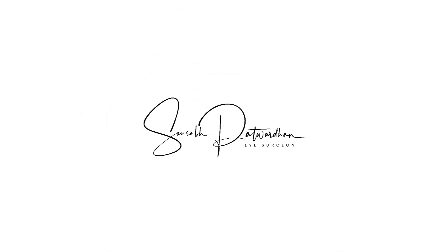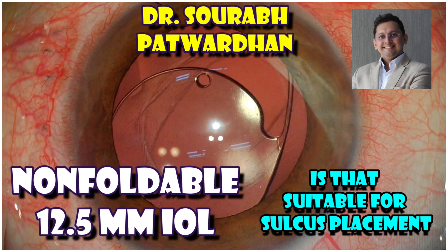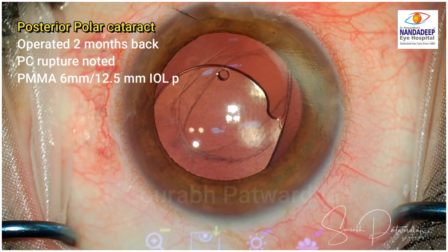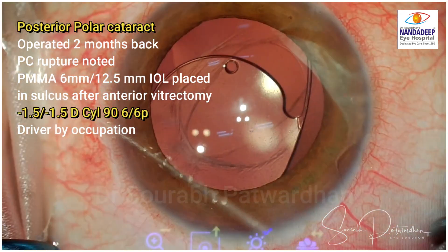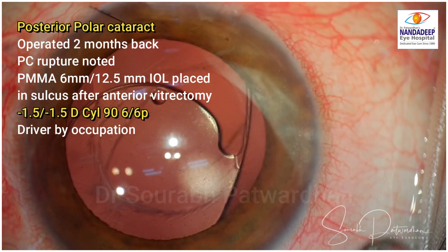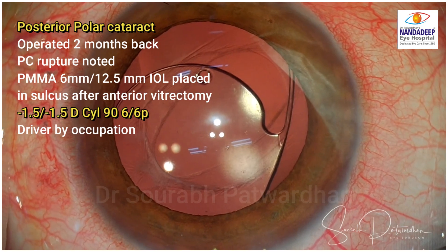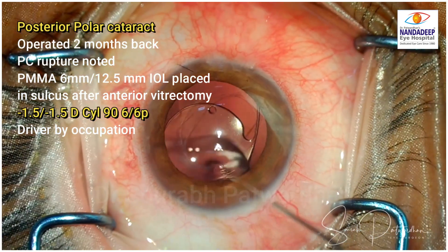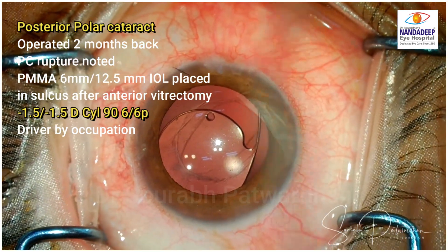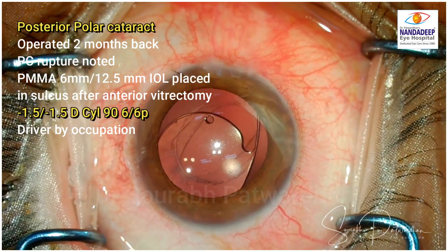When there is a PC defect and we have to place the IOL in the sulcus, most commonly we use a non-foldable larger optic IOL which is the least expensive option. This is a case where the patient had posteropolar cataract. The other eye was operated elsewhere and the surgeon noted PC rupture. After anterior vitrectomy, a PMMA IOL of 6mm optic and 12.5mm overall diameter was placed in the sulcus. This patient was suffering from some refractive error — there is cylinder as well as spherical error. The patient was a driver by occupation and was having trouble with glares, as the optic edge is coming into the pupillary area.